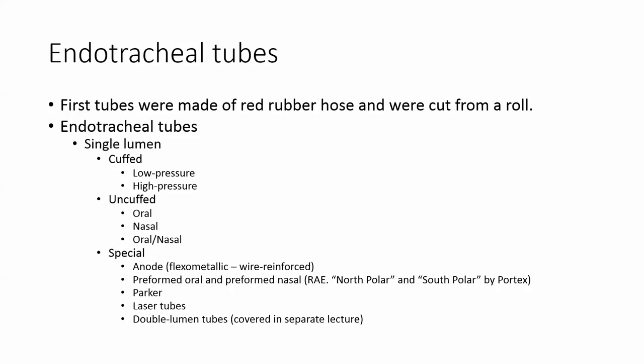And over time, it became important to develop materials that were less irritating. So now we have PVC tubes that are implant tested and shown to be fairly inert.